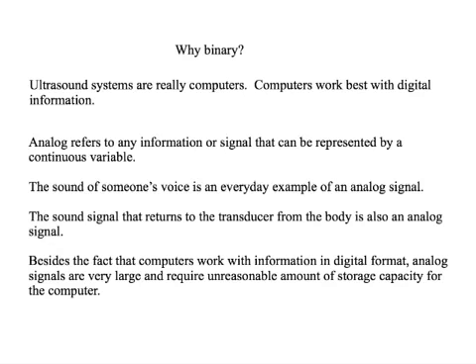To understand binary, we need to understand the terms analog and digital. Analog refers to any information or signal that can be represented by a continuous variable. The sound of someone's voice is an everyday example of an analog signal. The sound signal that returns to the transducer from the body is also an analog signal. Digital refers to discrete numerical values rather than continuous.